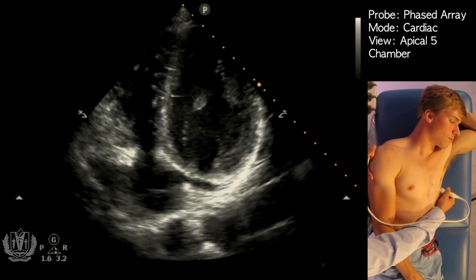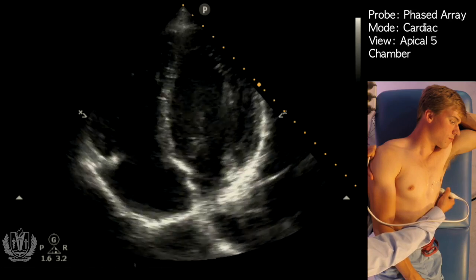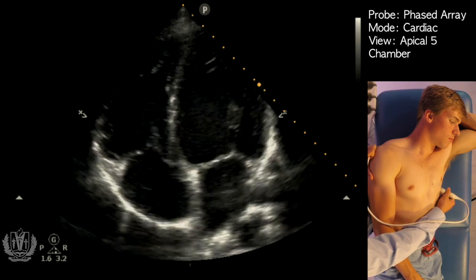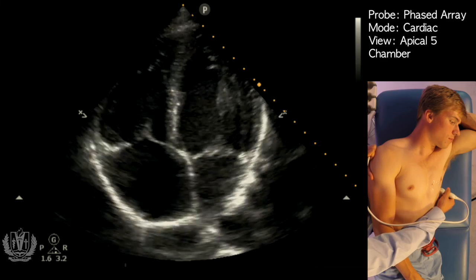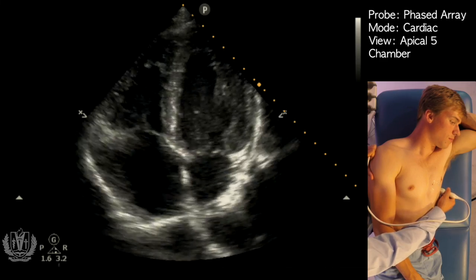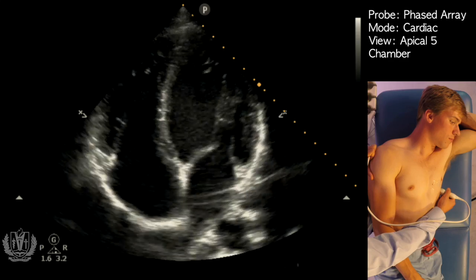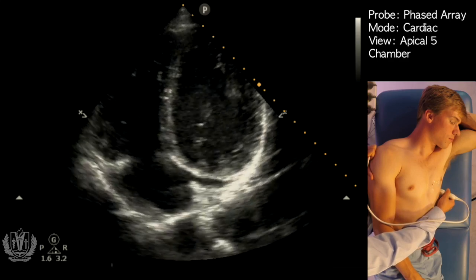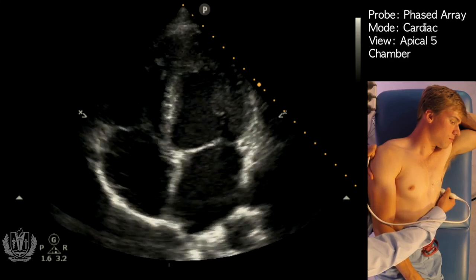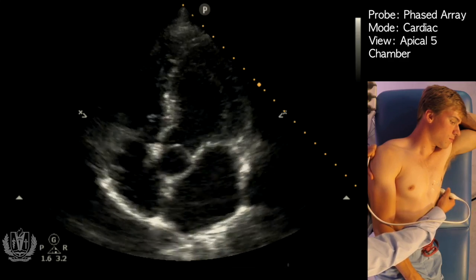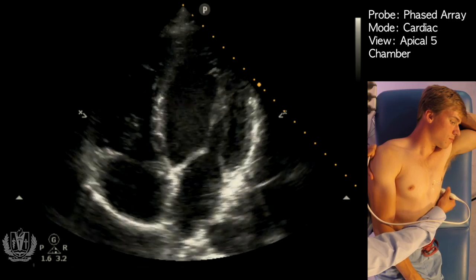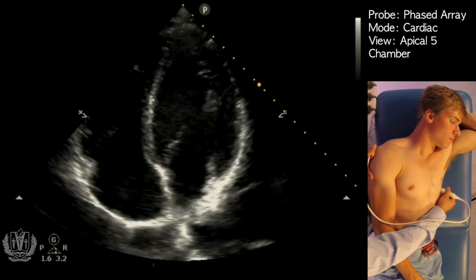This view is good for comparing the right ventricle to the left ventricle, especially in patients with pulmonary embolism when you want to see if the right ventricle has been dilated. You can also assess the sizes of the atrial chambers to see if there's any dilation in the left or right atria.